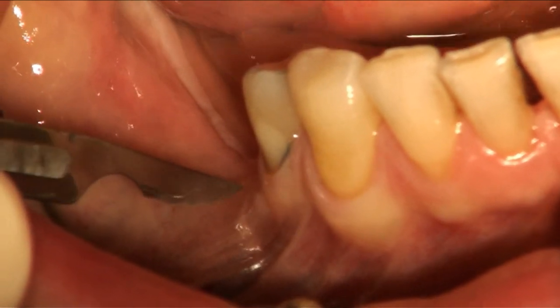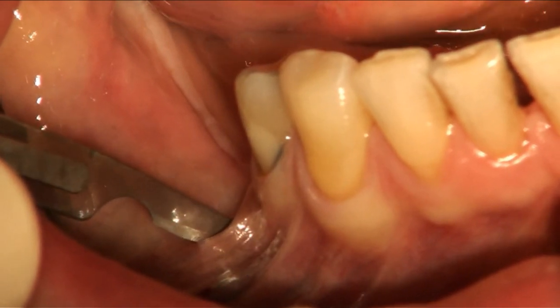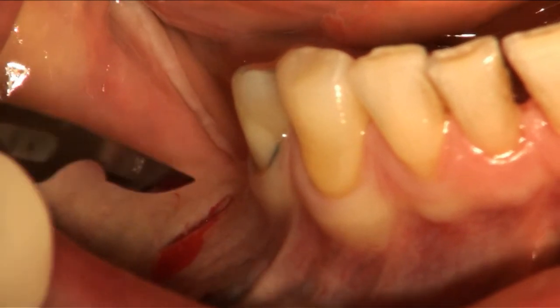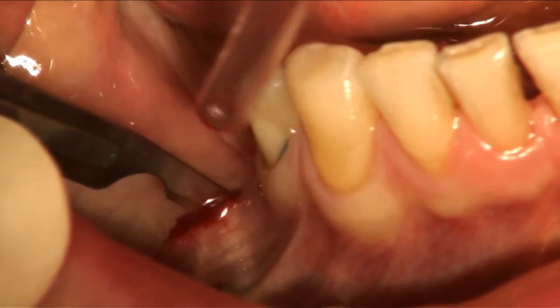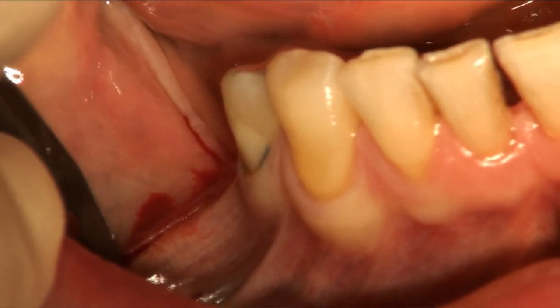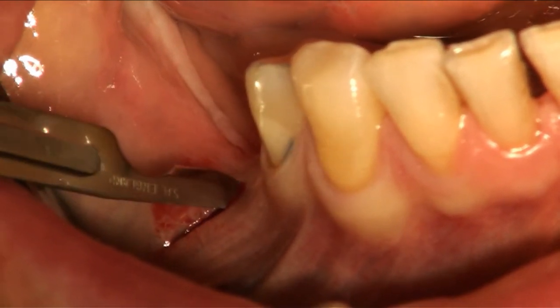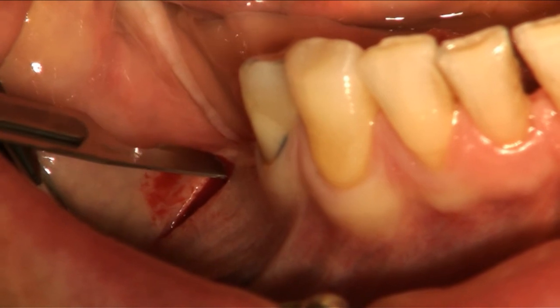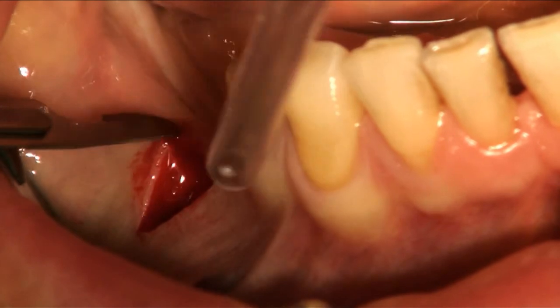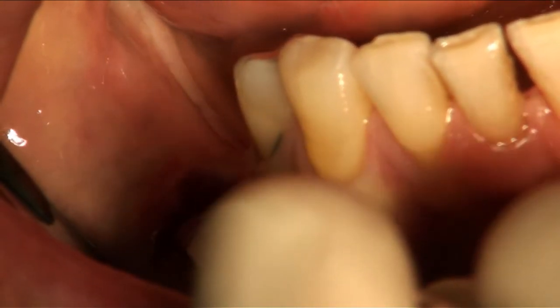we start with a vertical incision in the mucosa. And we do not cut the periosteum. We stay in the connective tissue. We make a little bend to the distal aspect for better access. And then we begin to split the connective tissue.